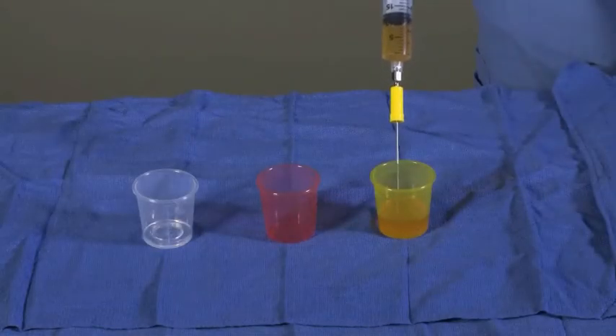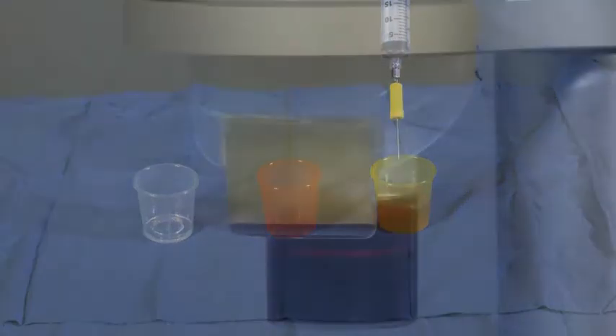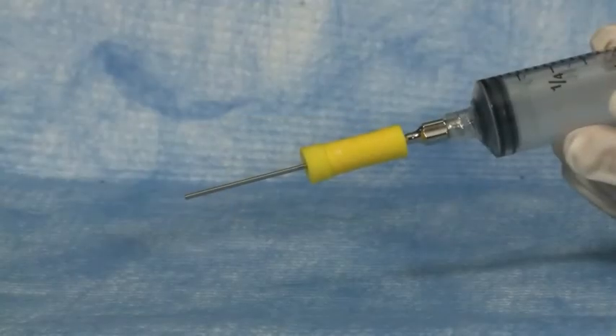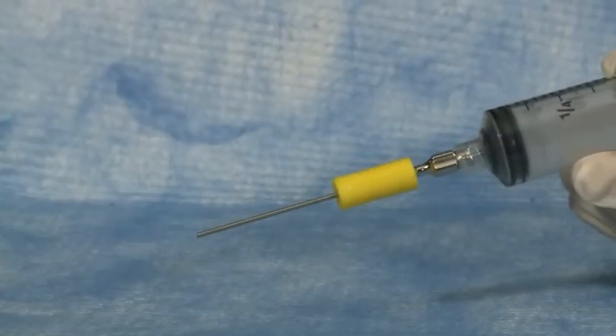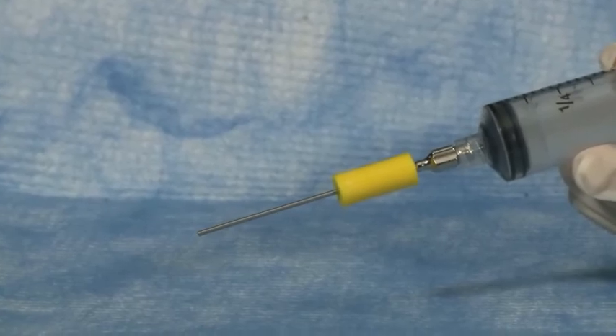Withdraw platelet-poor plasma volume from the plasma chamber until air enters the syringe. Transfer the recovered platelet-poor plasma into the yellow cup located in the surgical field or discard. Approximately 10 mL of plasma and platelet concentrate will be left behind in the APC60 process disposable with both spacers in place. If a further concentration of platelets is desired, removing the smaller of the two spacer guides will leave behind approximately 7 mL of plasma and platelet concentrate.